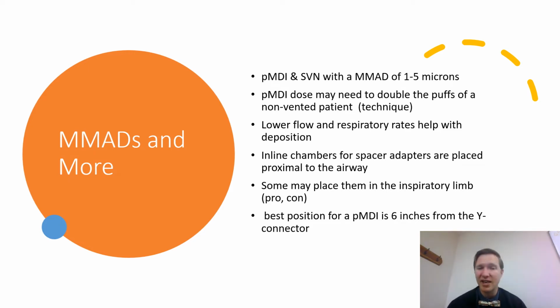Well, we can't say, okay, sir, madam, on the ventilator, when you take a breath in with the machine, you just take a deep breath and hold it. No, it's not going to work very well. Your timing is going to be very hard with these patients that are under sedation. They're going to be anxious. They have a tube stuck in their throat one way or another, so there's a whole lot going on in there. So the big thing is that technique. It's going to be tougher to get that proper timing with them. So that's where the double the dose comes in.